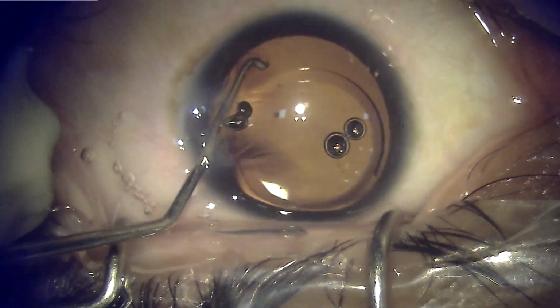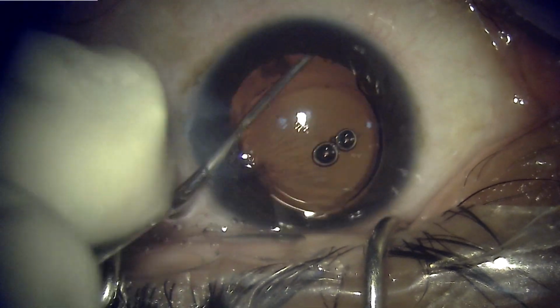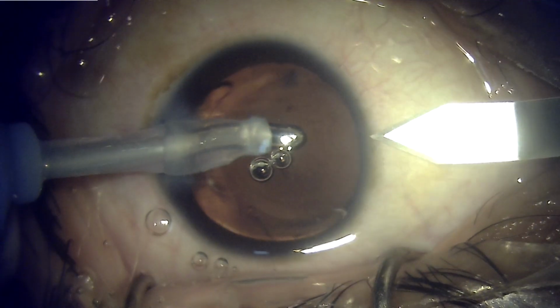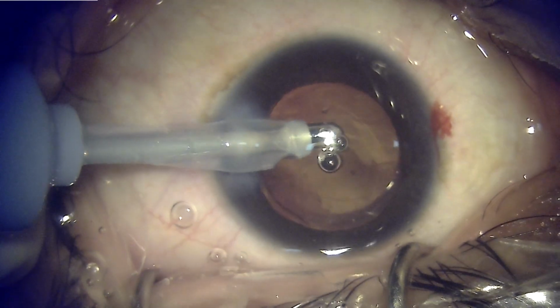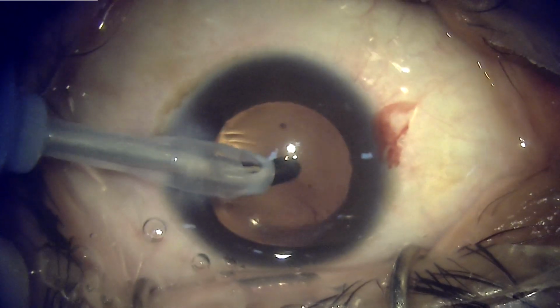Once the IOL is dialed into place, we remove the viscoelastic and also place an opposite clear corneal incision, and this will take care of the astigmatism. And the surgery is done.